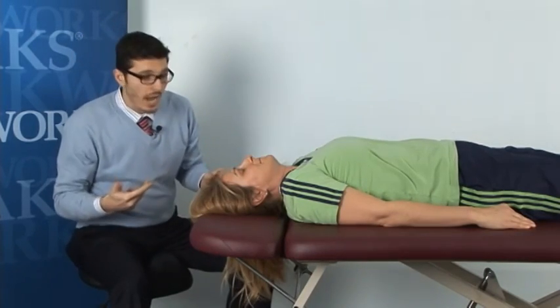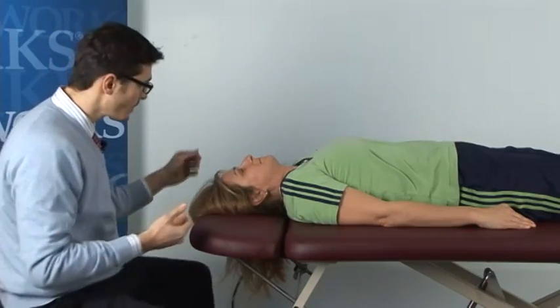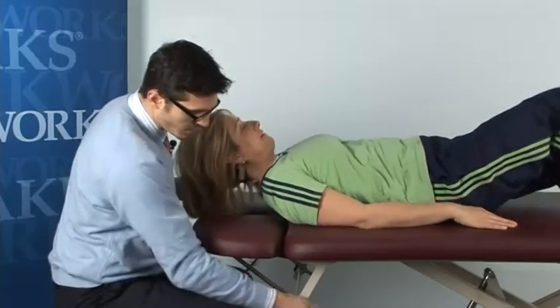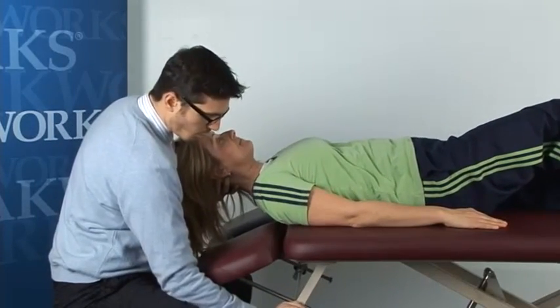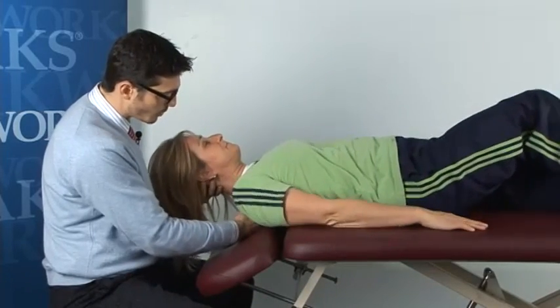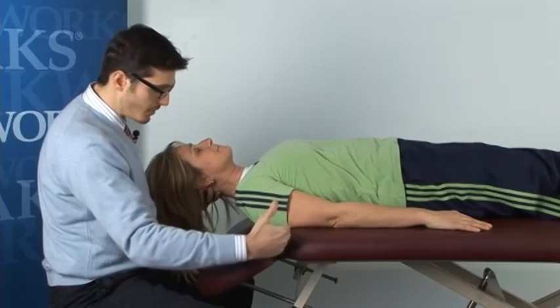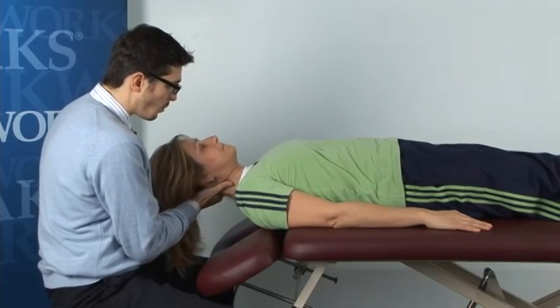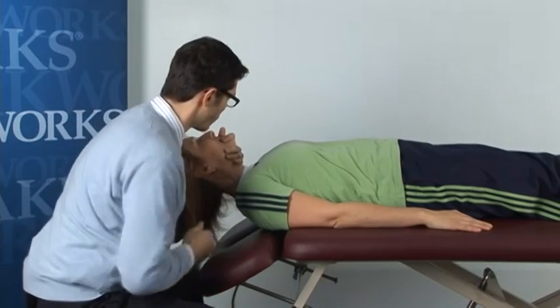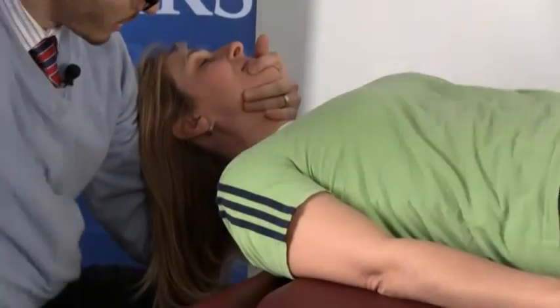Now, this is a right-sided symptom feature, so I'm going to get onto this side. And what I'm going to have you do is go ahead and I want you to slide off for me here. And so with Oakworks' smooth transitioning table, I can get to that T2-3 area of that upper thoracic spine to get my patient in a nice position. I'm going to employ the chin cradle grip, okay, where she's just going to rest. And I'm just going to make sure that she's in a comfortable position right here, okay?